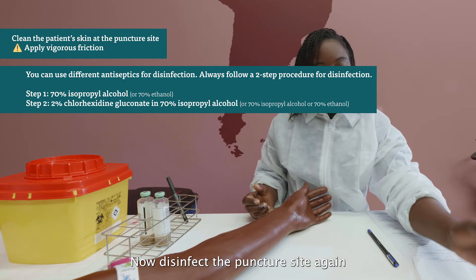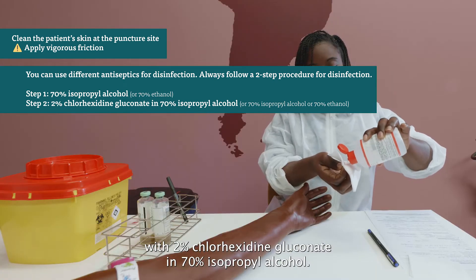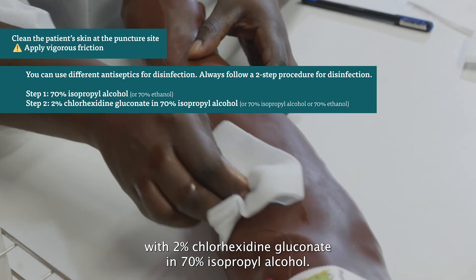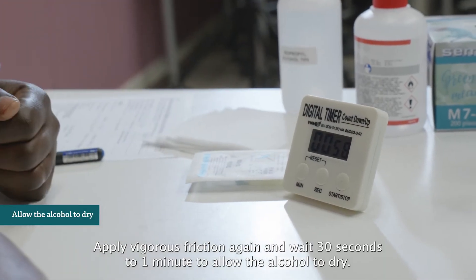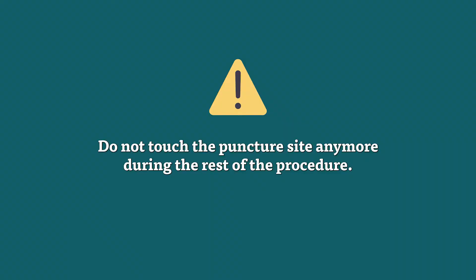Now disinfect the puncture site again with 2% chlorhexidine gluconate in 70% isopropyl alcohol. Apply vigorous friction again and wait 30 seconds to 1 minute to allow the alcohol to dry. Do not touch the puncture site anymore during the rest of the procedure.